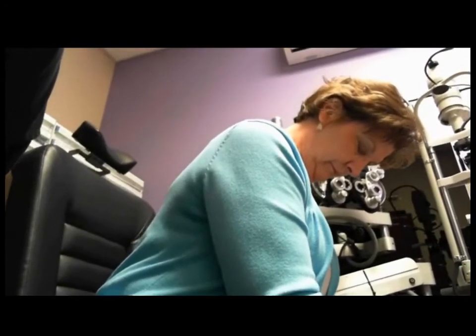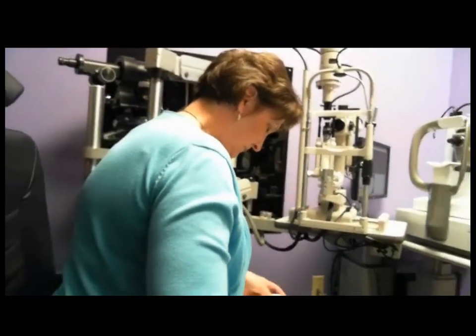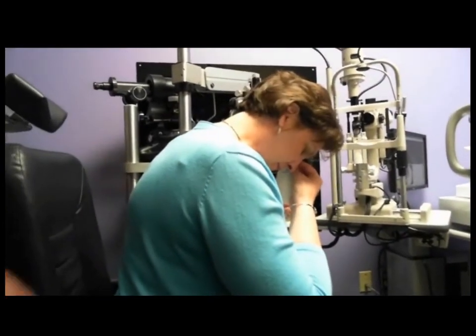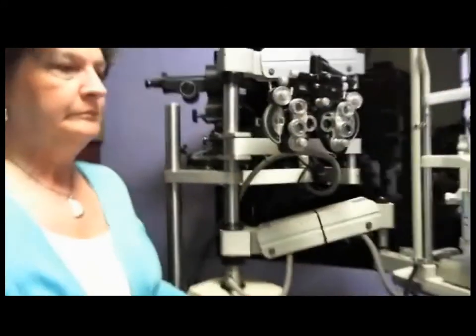That's great. Now, I'm going to warn you that not every patient is this compliant. Darlene did a great job in not flinching. But a lot of times you're going to have the patient flinch as soon as you come close to the cornea. So let's see how we did on the other eye. And it looks very, very good. I don't see any visible air bubbles.